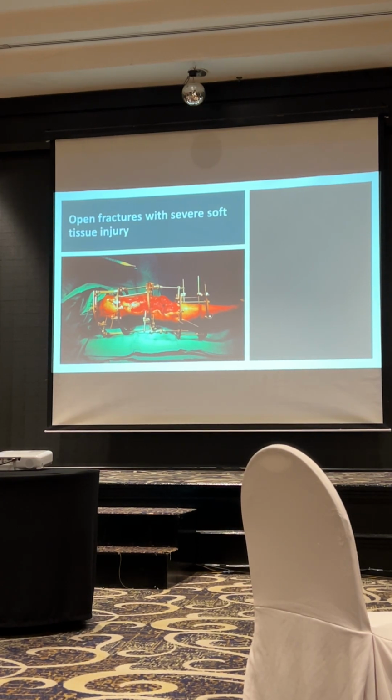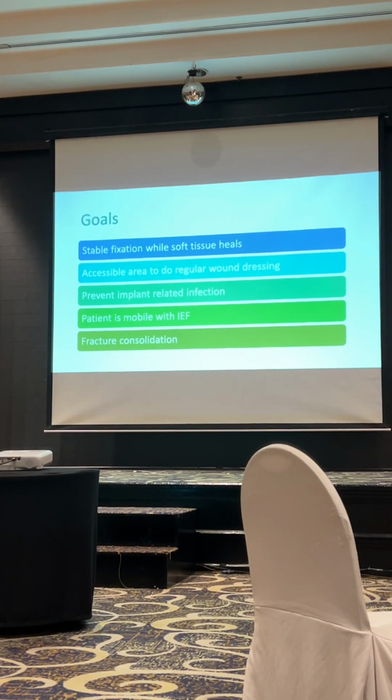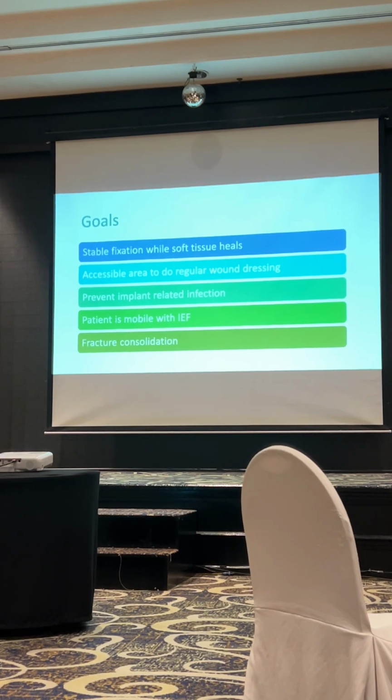So in this particular photo example, the goal of the treatment is to have a stable fixation while the soft tissue heals. You want to plan your Elizarov so that you have an accessible area to do comfortable regular wound dressing, prevent implant-related infection, make sure the patient is always mobile on the Elizarov, and finally achieve fracture consolidation.